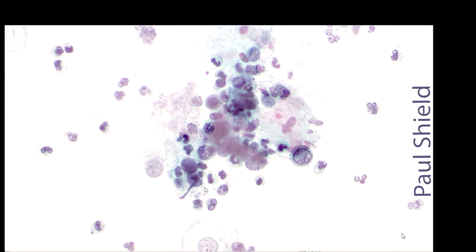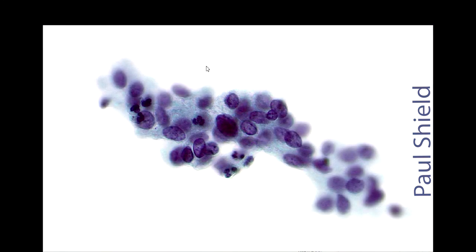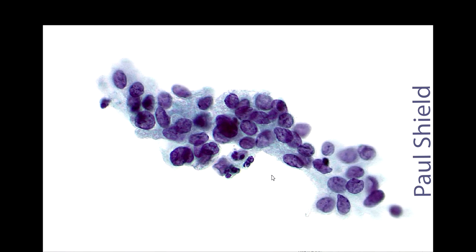Intermediate cell, debris, neutrophils, and here are again high-grade SIL cells. So notice how little cytoplasm they have, very high NC ratio, quite irregularly shaped. That one down there has quite coarse chromatin. This is a little loose group of them, and if I focus up and down you can see there's quite a lot of variation in size and shape. That's always very helpful. They're very hyperchromatic.